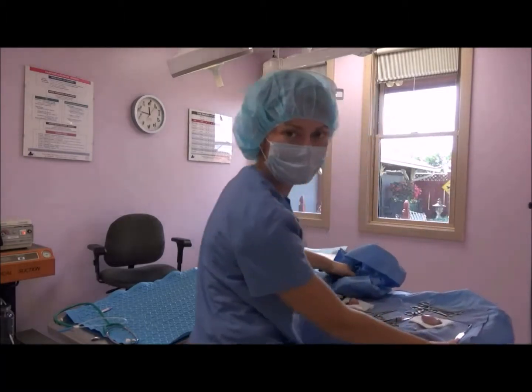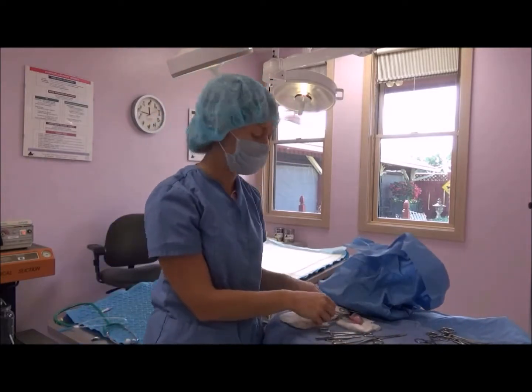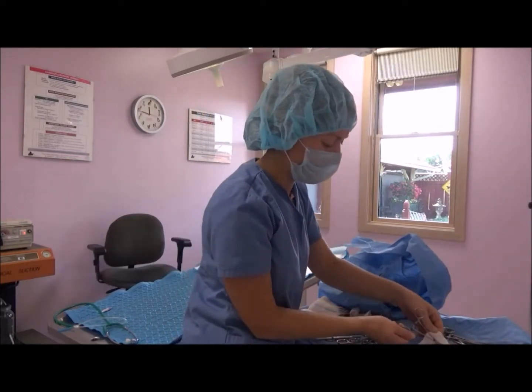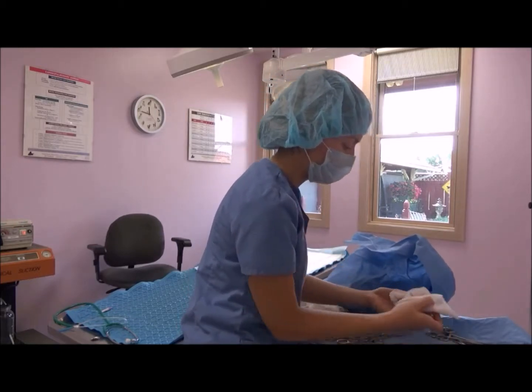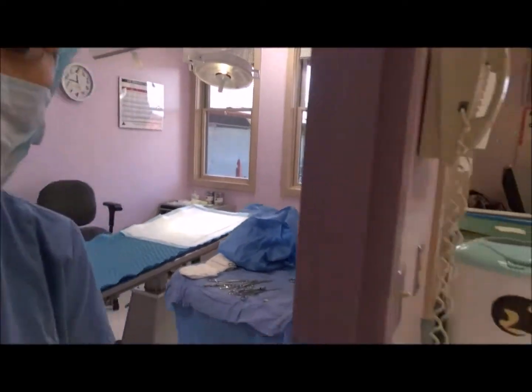So I'll bring this a little closer here. On here, from our canine castration, we have the testes. So we're going to dispose of them into our medical waste bag. The first thing we do here, we weigh them.